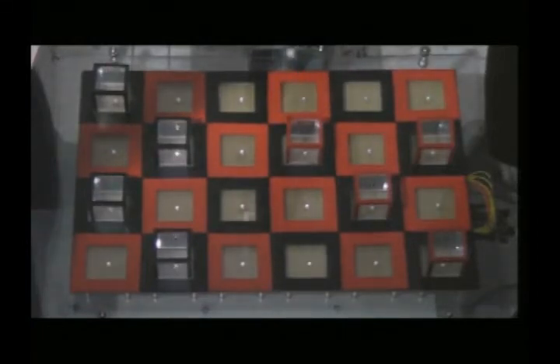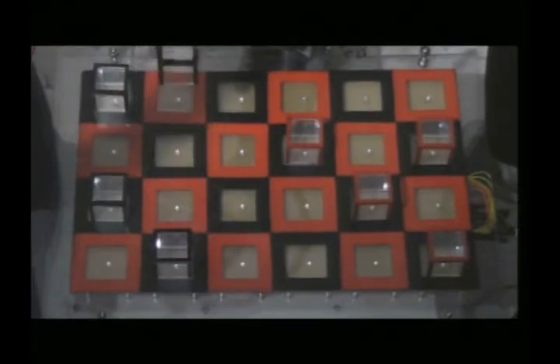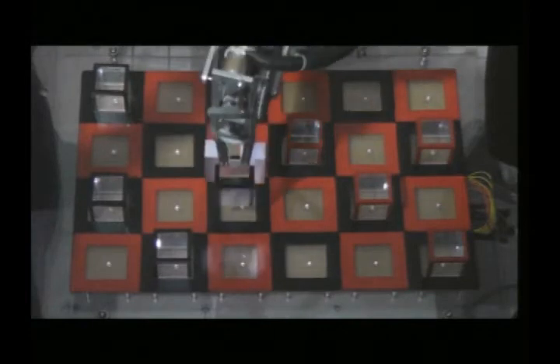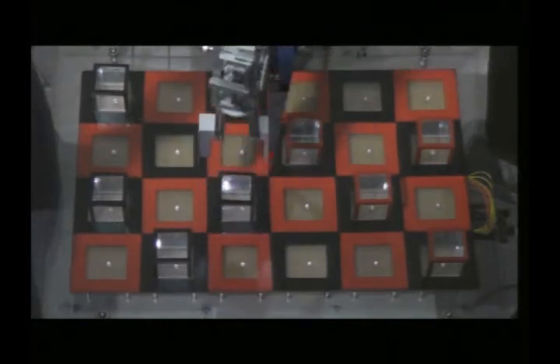So then the next person's turn, you can see that these 2 lights are flickering, one at 10 hertz, the other at 13 hertz. After 2 seconds, the classifier starts. It once again picked the 13 hertz signal. And then the player will have a choice again between these 2 spots. And then I think it picks the 10 hertz signal on. Yep, and then this moves over here.